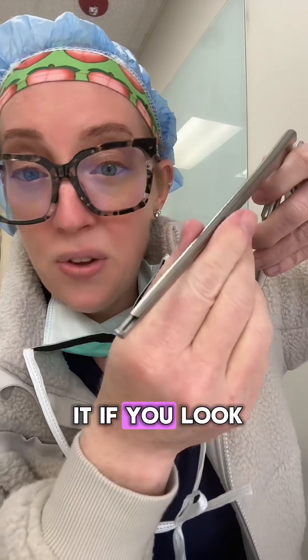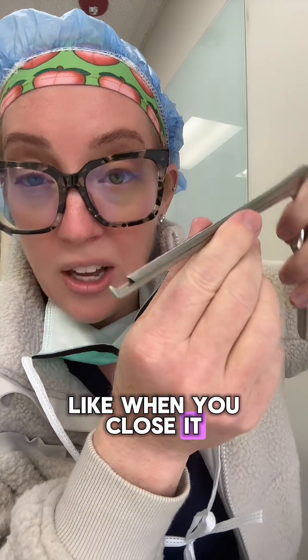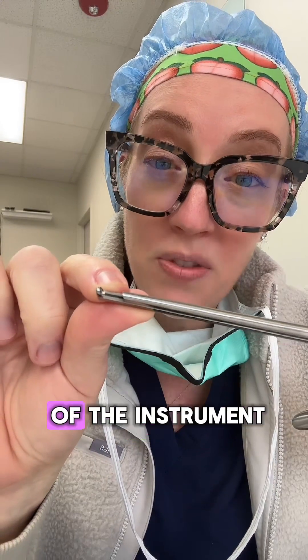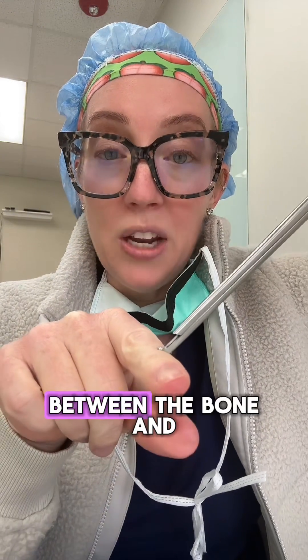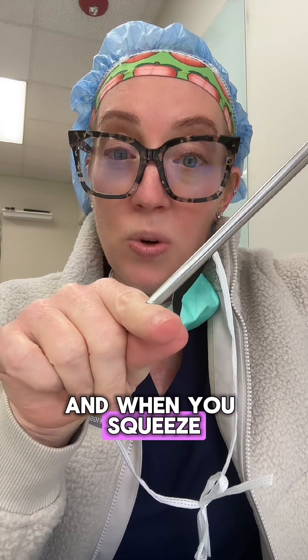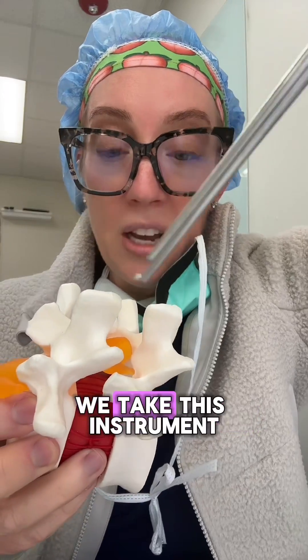If you look at the distal tip of the instrument, that's what it looks like when you close it. The tip of the Kerrison is very smooth, and the cutting part is between this part of the instrument. What you do is slide it between the bone and the dura — the covering of the nerves — and when you squeeze it, it will carefully cut bone.